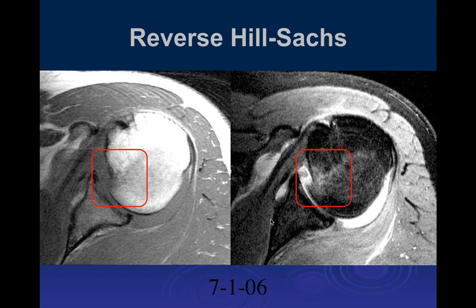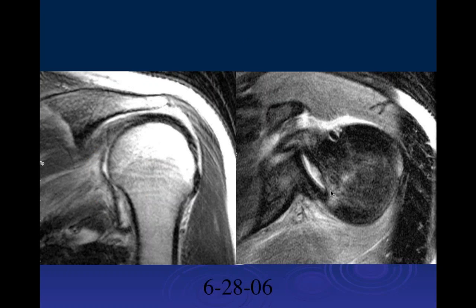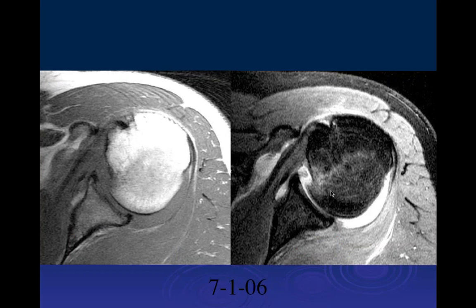So this is just what a reverse Hill-Sachs lesion looks like. Most of the time when you see these, you'll see this view and not this view. But now you can just see what the progression is. And when you see this characteristic appearance, then you can raise the issue of a recent posterior dislocation with a reverse Hill-Sachs lesion. I'm not sure what that is.